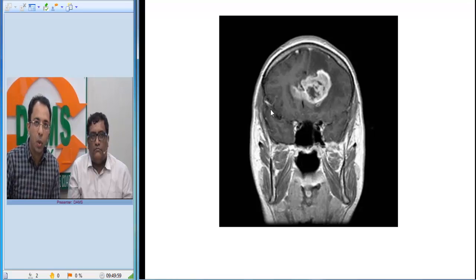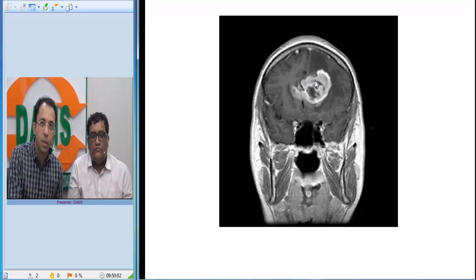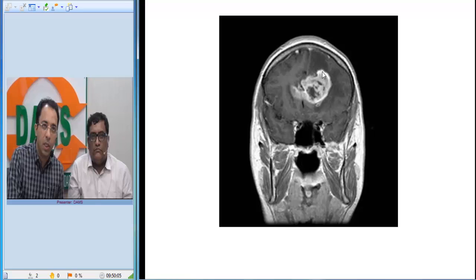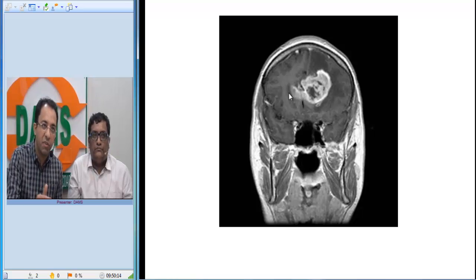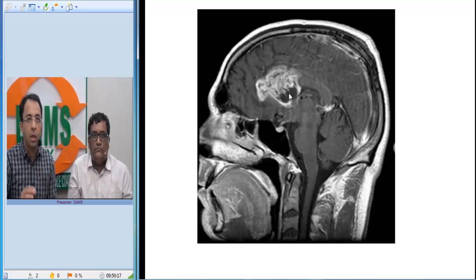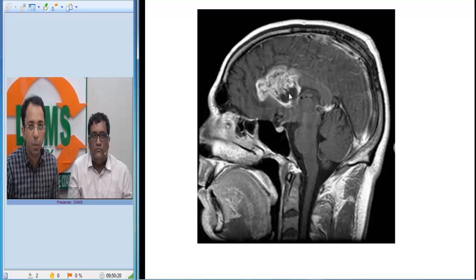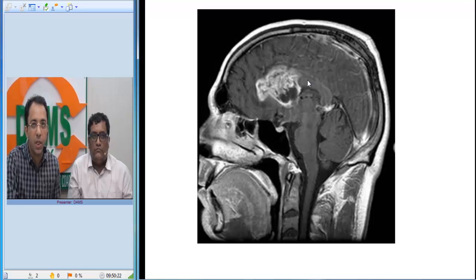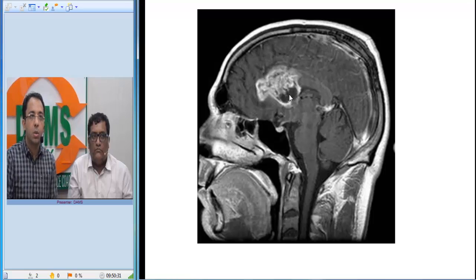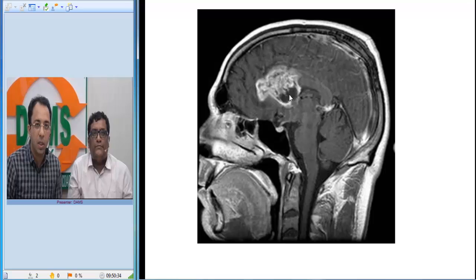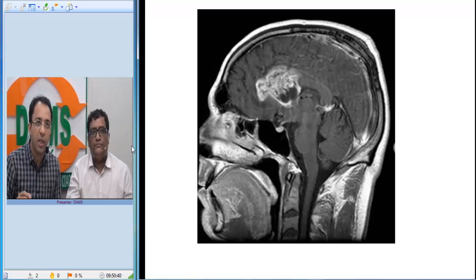Looking at the coronal image of the same patient, you can see the intra-axial tumor within the white matter, areas of enhancement, areas of necrosis, crossing the midline to the opposite side — again re-emphasizing a high-grade glioma, probably glioblastoma multiforme. On the sagittal image, you can see the corpus callosum with a heterogeneous infiltrative tumor involving the anterior part with areas of necrosis. My diagnosis on the available images is glioblastoma multiforme. I now invite Dr. Sanjeev to discuss the pathological findings.